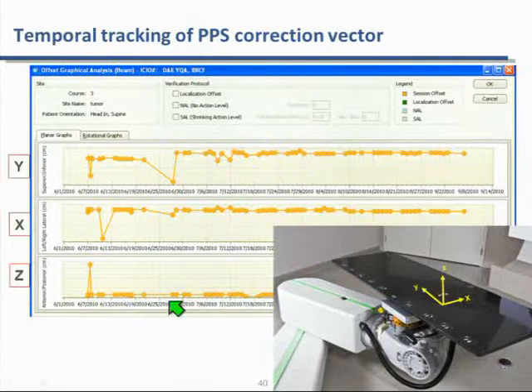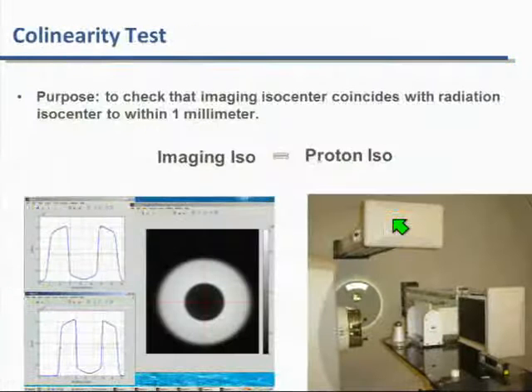And these are XYZ motions that we built in initially, because when you put that device on the table, it's offset by a certain X, Y, and Z, and then you bring it back to that position and record what the offset is. There are some outliers here when you do reference readings or baseline it, but pretty much the motions are within a millimeter, as you would expect from this highly accurate robotic arm.